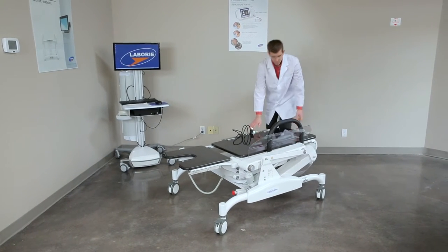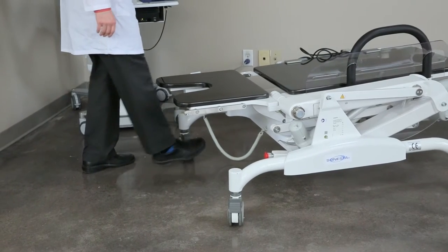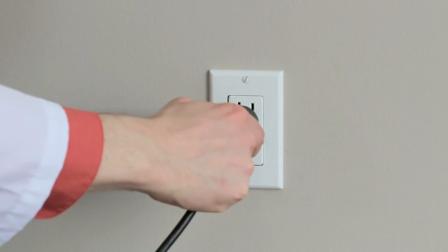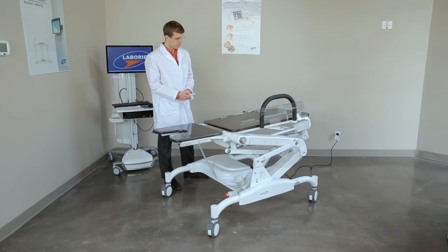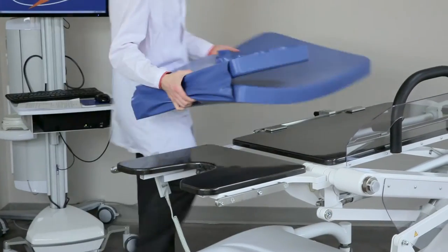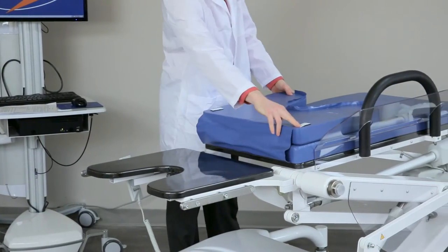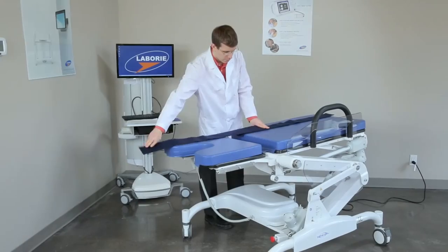Move the table to a clear and convenient location and apply the brakes. Plug the power cable for the table into the wall and raise it to a convenient height using the top left button on the hand control. Place the seat cushion on the table, applying the self-adhesive velcro strips to hold it in place.